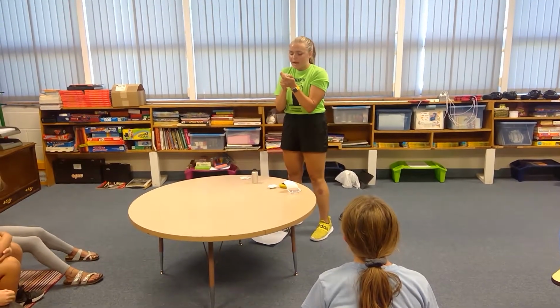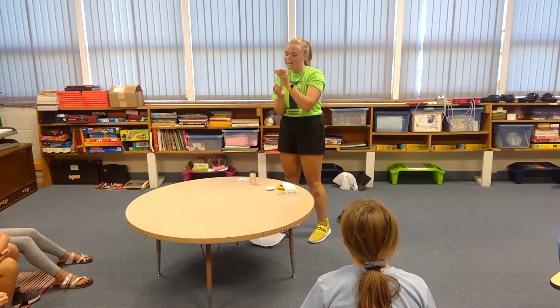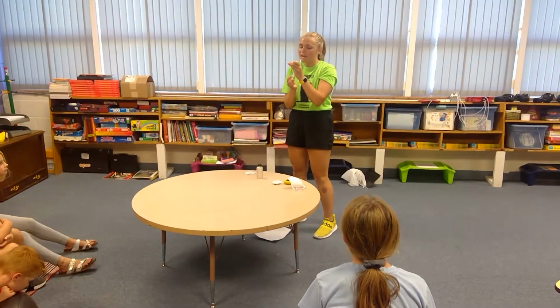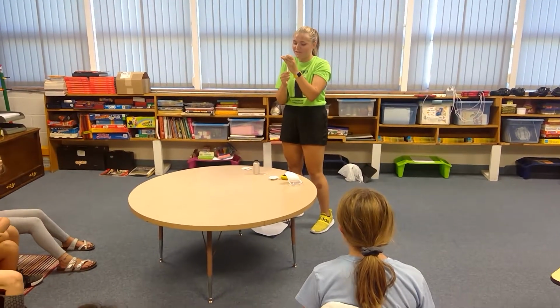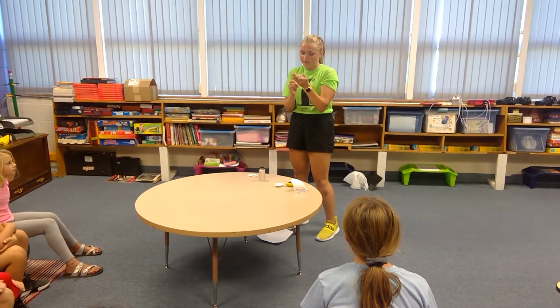So I draw it up, and I figure out how much insulin I need based on how much I need every 3 days. So if I need 50 every day, how much would I need in 3 days? Does anybody know? Yeah? 150. 150. So that's how much I'm going to be putting in today, okay? If I can get it drawn up.